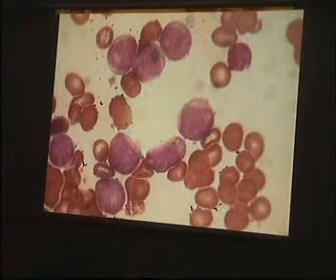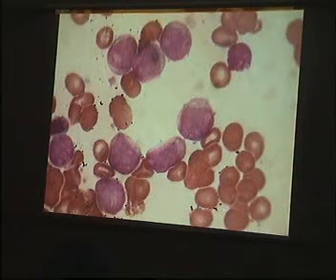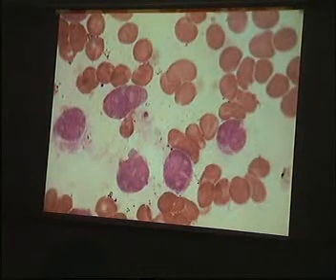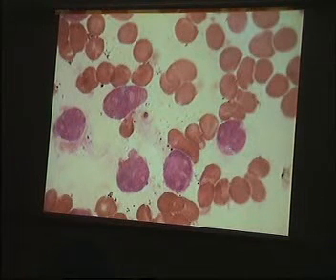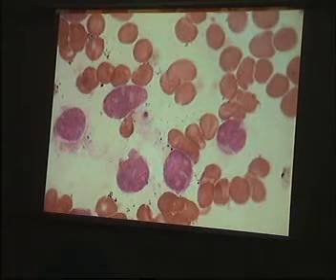If you see further over here, there is an indentation here, a little bit of granules here, polar granules, and a nuclear indentation here. Can you make out that wedge? Very typical of a promyelocyte. You can see the nucleoli over here. Next slide. You can see again the wedge over here. These are promyelocytes, and you can see the beautiful wedge with polar granularity here. Very typical of a promyelocyte. This is an APML.